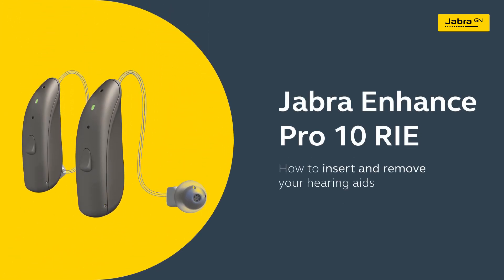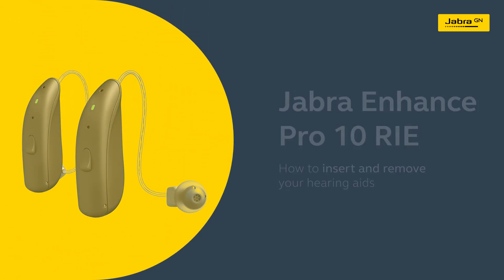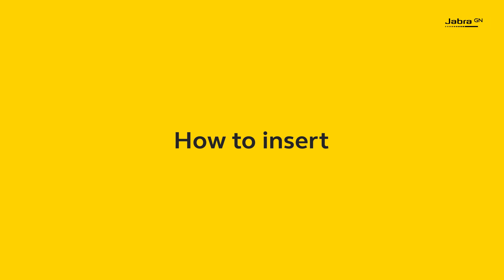How to insert and remove your Jabra Enhance Pro 10 RIE hearing aids. Inserting the hearing aid.